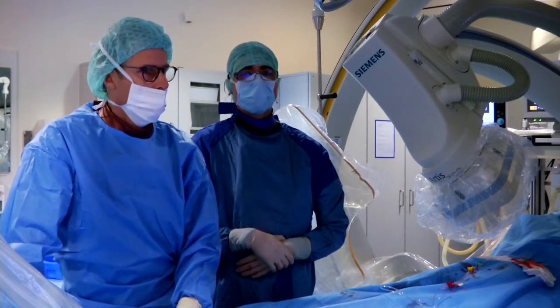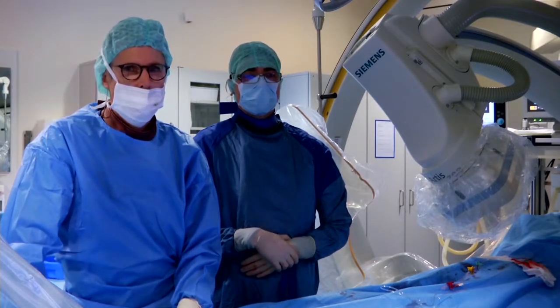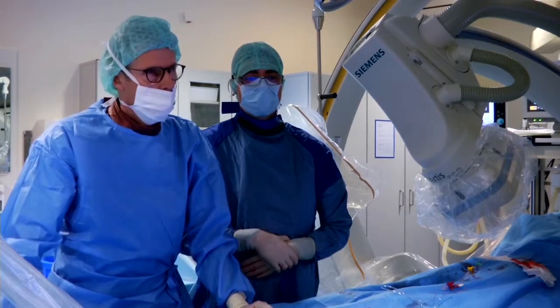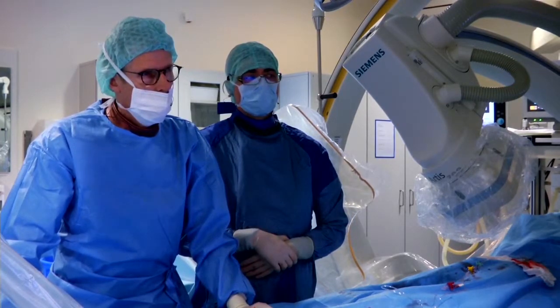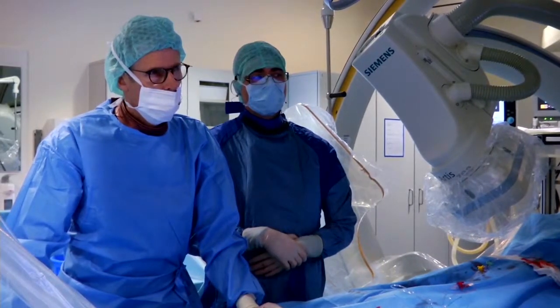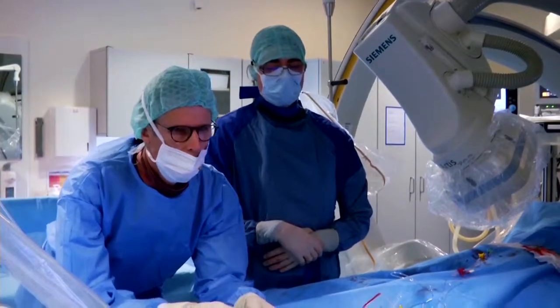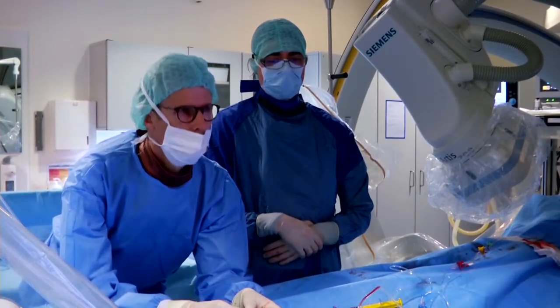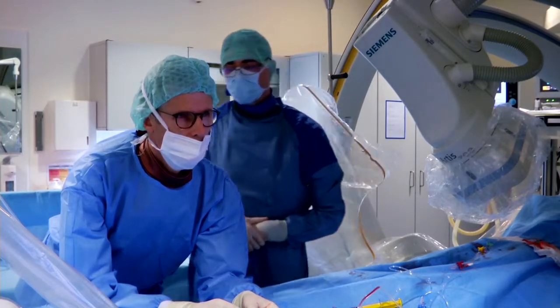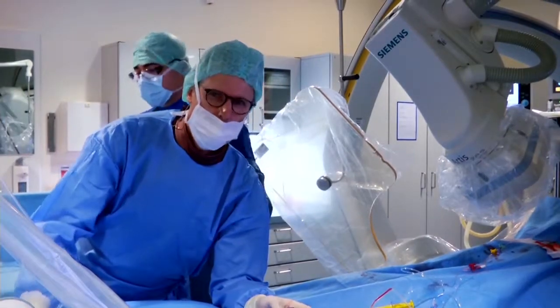Peter, there's another question from the audience. Go ahead, please. Yes, I have a question about the left subclavian artery. Why are you not dealing with it, because it looks so small today? I didn't get it. What is the subclavian? The left subclavian artery caliber is very small. Why didn't you deal with it, or why didn't you have a plan to deal with it today, please?